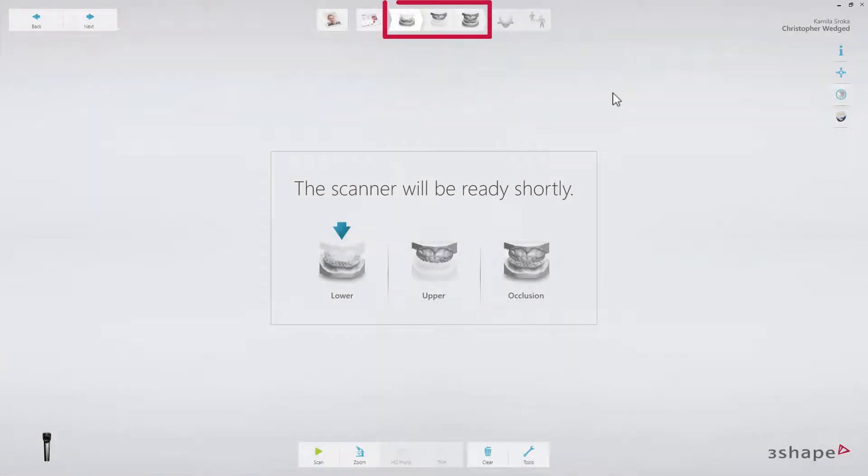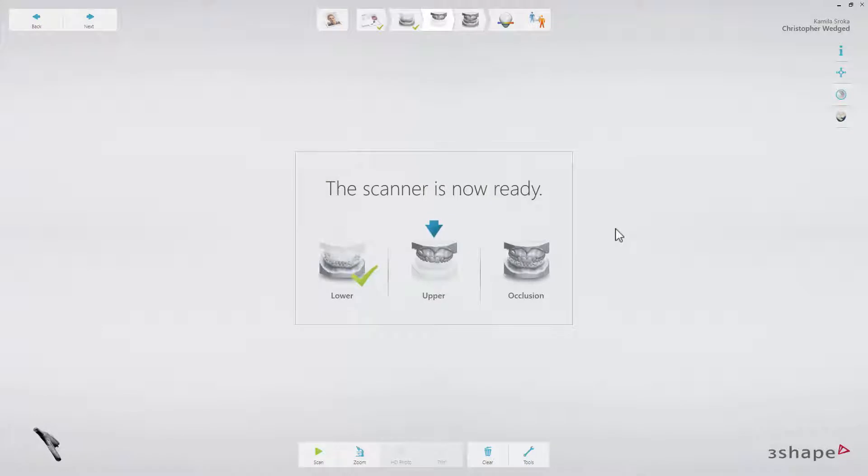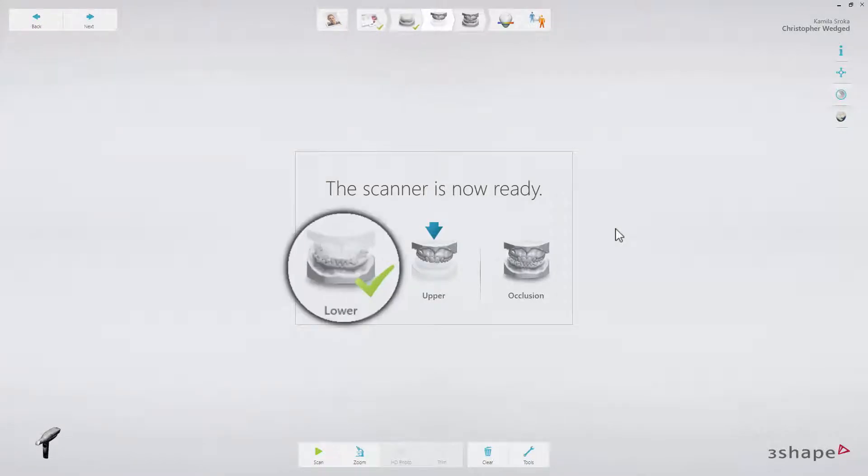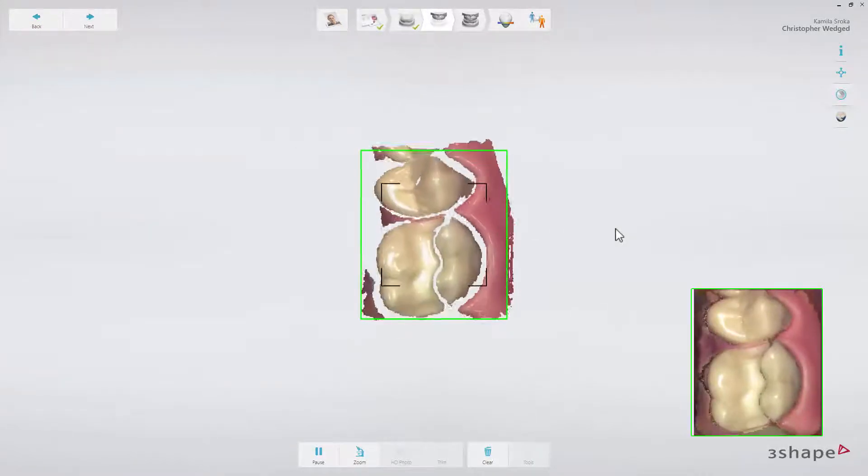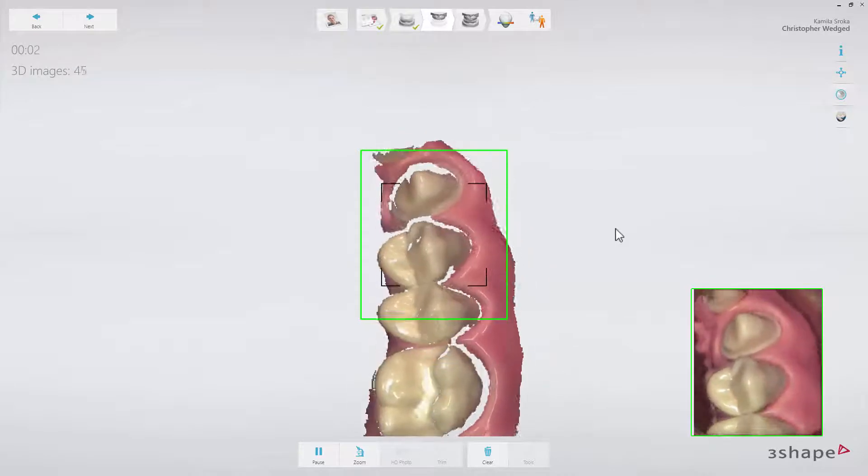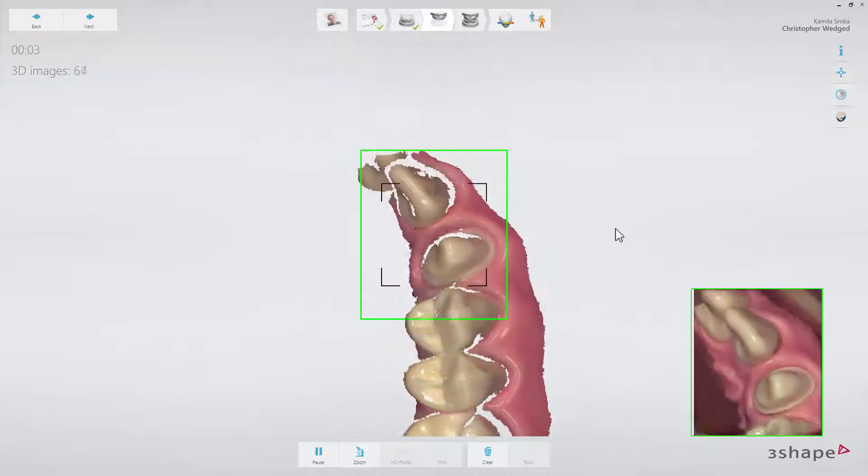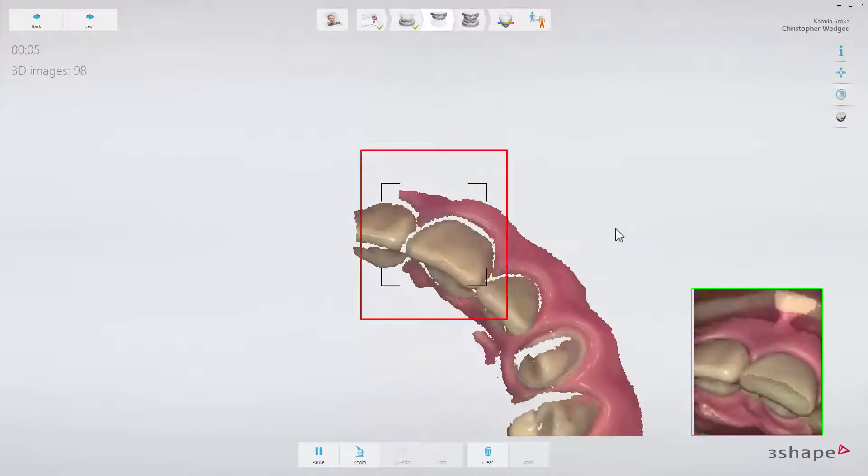The current step in the workflow bar will always be highlighted. All previous steps that have been taken and completed successfully are marked with a small green check. A step will appear disabled if the previous step has not yet been completed.